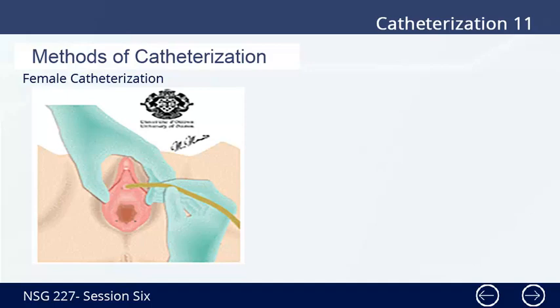25. Secure the catheter to the upper thigh with tape. Leave some slack in the catheter to allow for leg movement. This prevents the catheter from pulling on the urethra as the client moves. 26. Check that the drainage tubing is not kinked. Attach the collecting bag on the side of the bed, keeping the bag at or below the bladder level. This facilitates drainage of urine and prevents the backflow of urine.